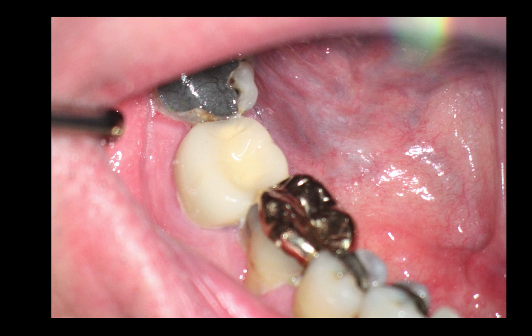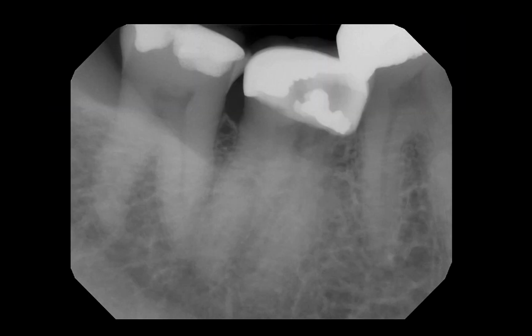This was a 75-year-old patient, and he was referred to me for me to take a look at the resorption on tooth number 31. And this is what it looked like clinically. And remember I said earlier that sometimes these teeth are in infraocclusion if the resorption happens early on in life. This is a 75-year-old patient. This tooth is in infraocclusion, and I think it is an infraocclusion because of the external cervical resorption that he had on the mesial of tooth number 31. These other teeth then erupted around it.